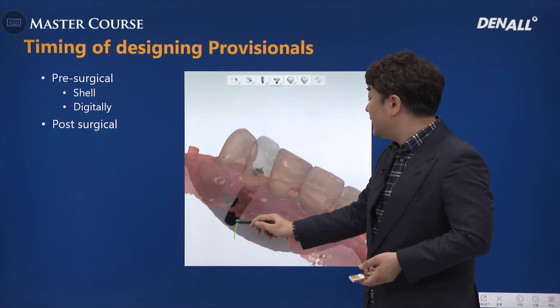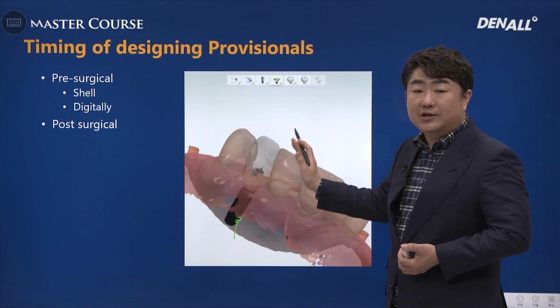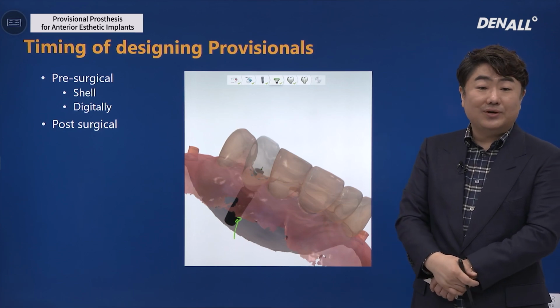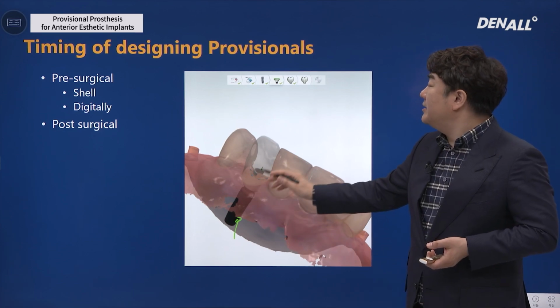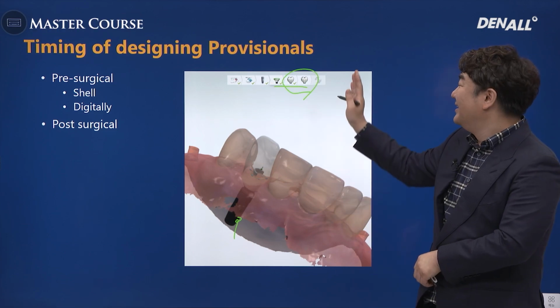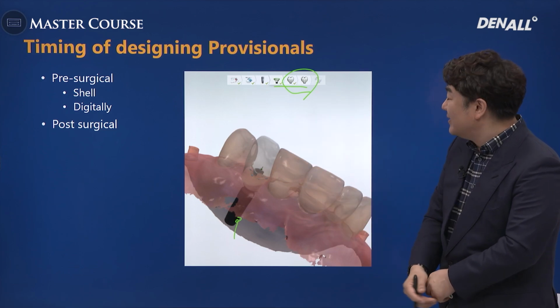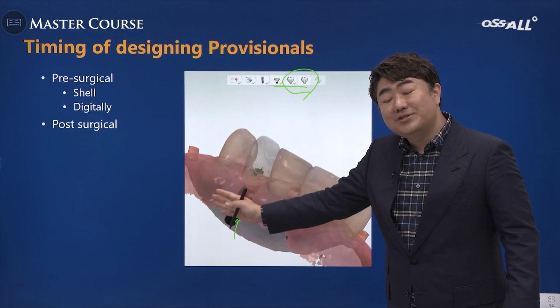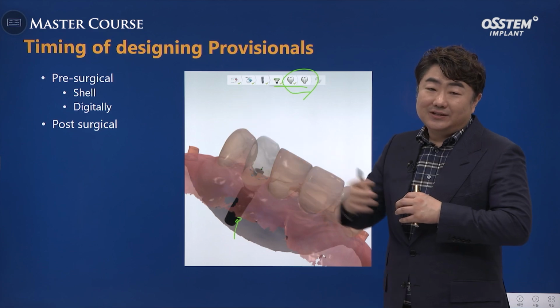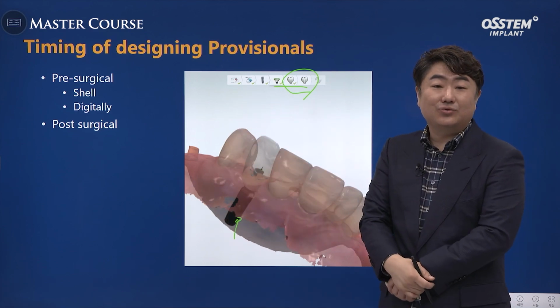If you're using digital dentistry and using implant guides, you can assume that the implant has been placed in the planned position and a screw-retained crown can be fabricated ahead. As we all know, on Implant Studio software, after planning, we can make a screw-retained crown. It may vary depending on the library provided by the implant company. You can make a surgical guide from Implant Studio and send the data to a CAD system and fabricate crowns separately.